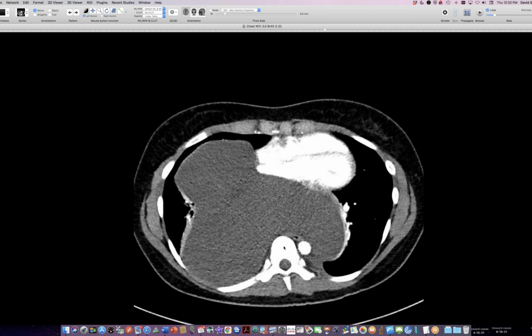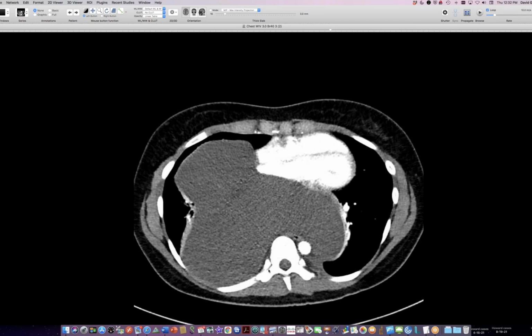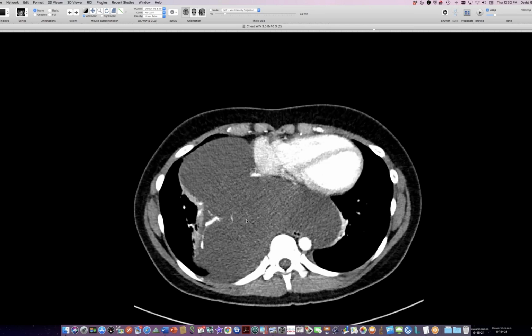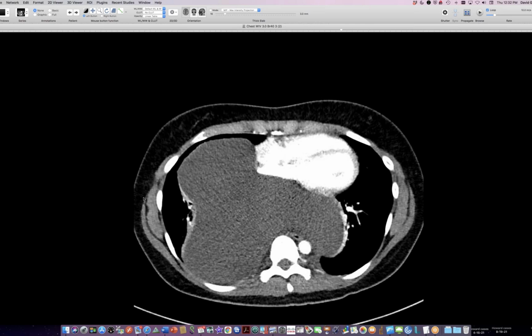And so one of the cases in the literature was also a 20-year-old, I think, woman, had very similar findings to this and so forth, and very similar MR findings with thin septations in this lesion. So Maya showed a case of chordoma after that, and it did have the thin septations and everything like that on MRI, as I recall. And so I was really set on that. Plus, I needed more cases of chordoma for my teaching file. So I was very eager to have this be chordoma.